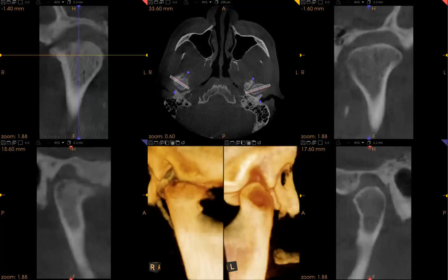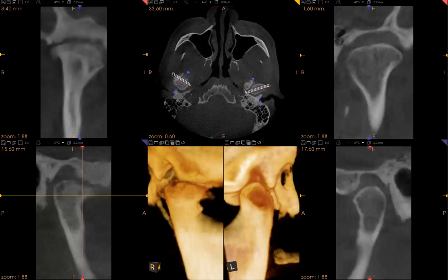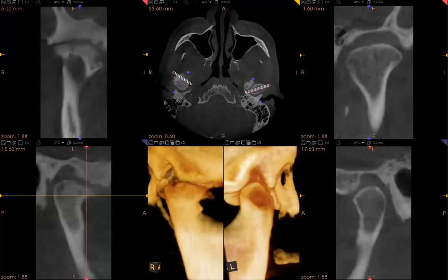When we look from the frontal view, we can see the same kind of thing — that the joint loses its integrity. In fact, looking at the articular eminence in this spot, we lose contour and integrity of the articular eminence as well.